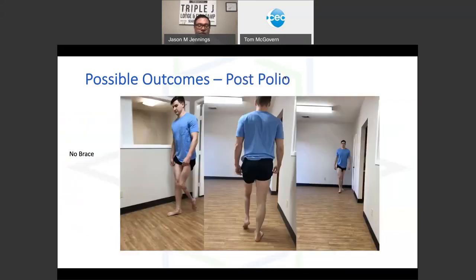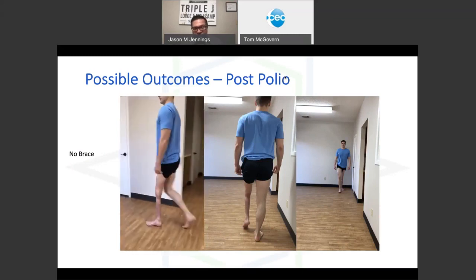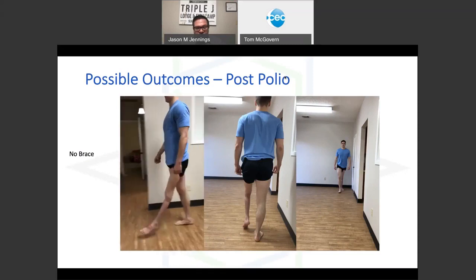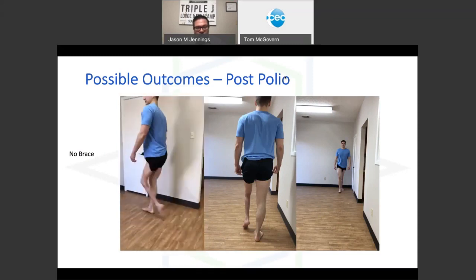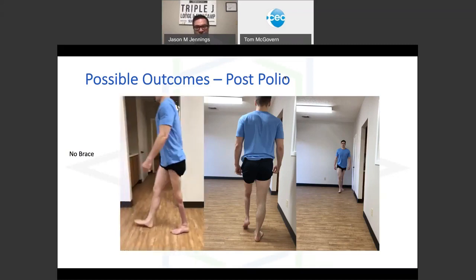This is a young man. He's one of four young folks in the US to get the polio virus from the live vaccine. Some of you may have seen him in my talks before. I like to show him as he's growing and has improved. That left leg is 2.5 inches shorter than the right leg, and his right foot size is a 14, and the left is about a 9. So he's about 5 sizes difference in size.